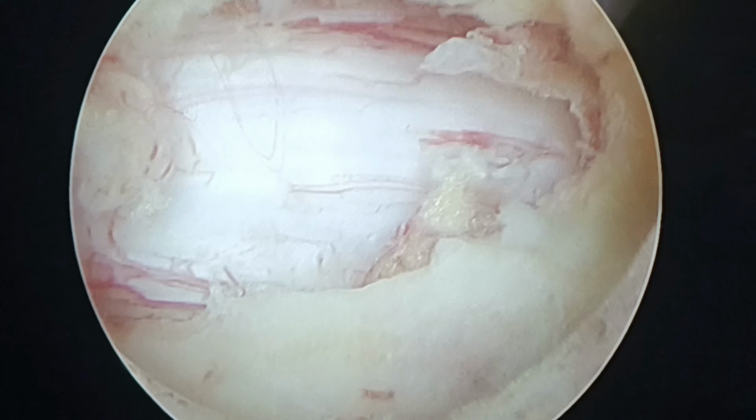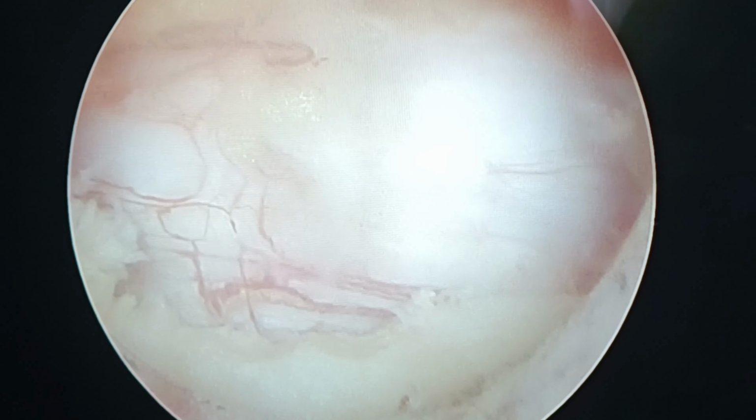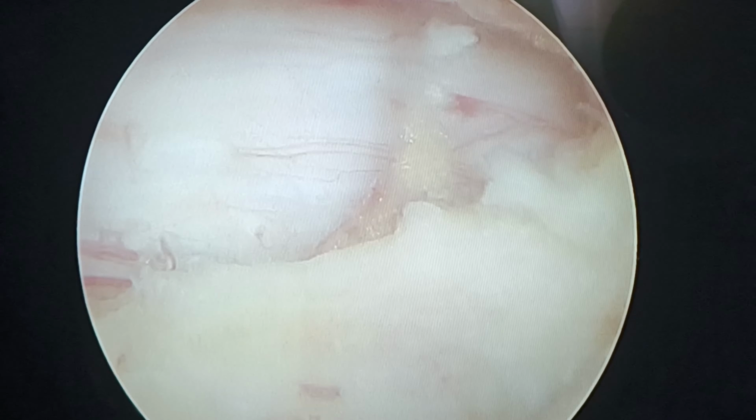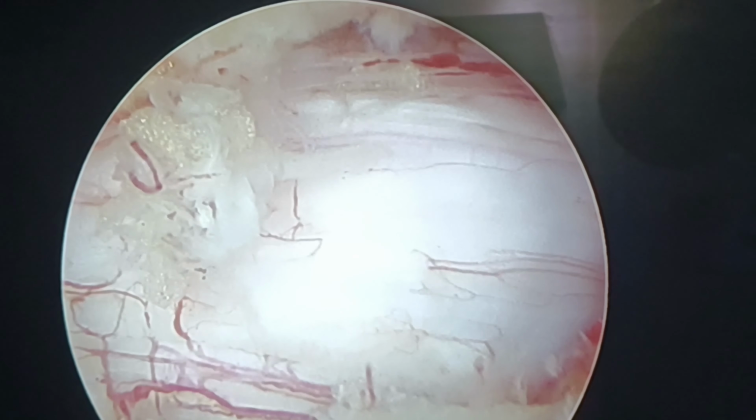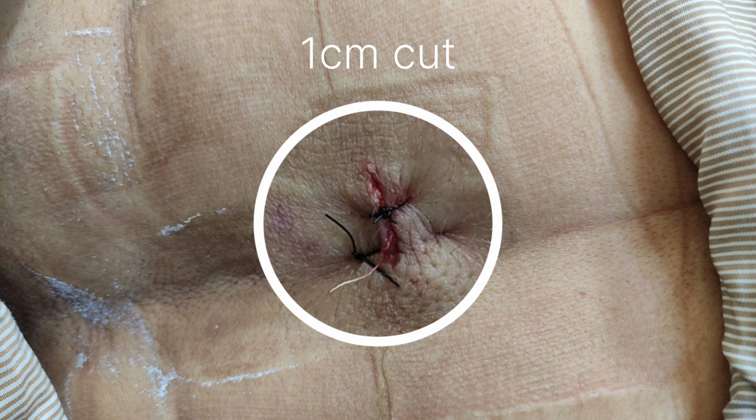This is the spinal cord, nicely decompressed, and it is pulsatile very well. On the opposite side, towards that right side, you can even see the root coming out of the thecal sac. And the whole surgery was done through a 1 centimeter single cut.